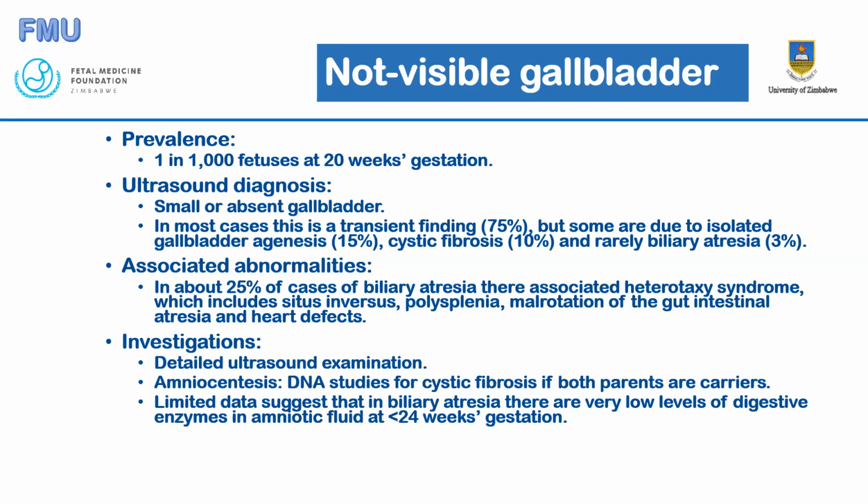but the location of the gallbladder is on the right of the liver. You are going to see the stomach bubble on the left, as always, with the abdomen. But on the right, if you go down on the liver, you are going to see a gallbladder, a cystic-like structure on the right. That is the baby's gallbladder. As you continue to slide your probe, when you're in transverse going down the liver, you will see it.